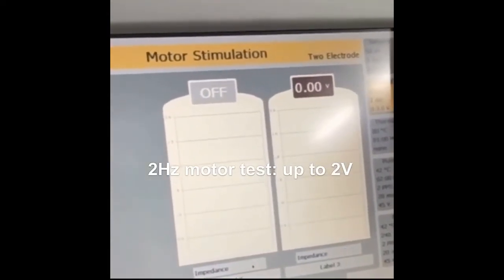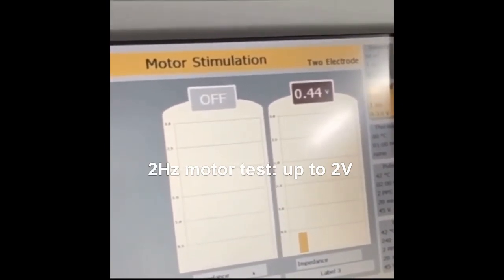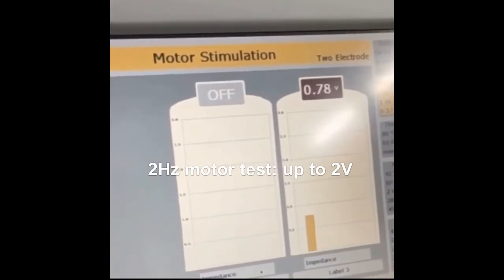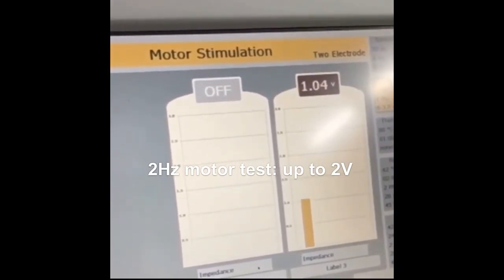Then we perform a motor stimulus using the parameters 2 Hz and 2 V, ensuring that the procedure is not reaching any motor branch. Thus, there should be no movement, not even muscle fasciculation.